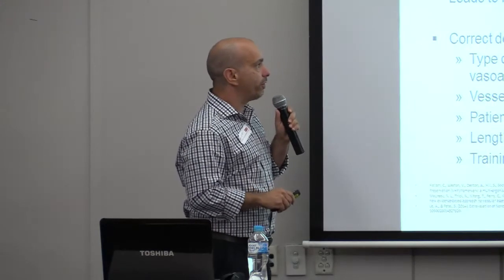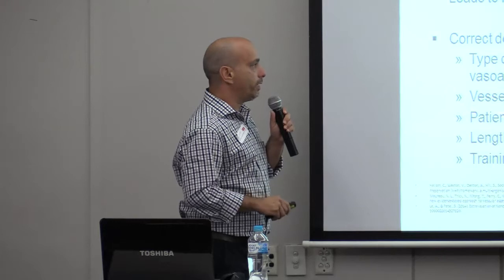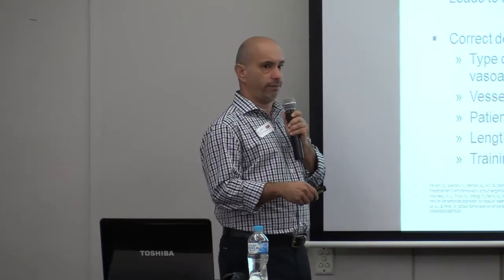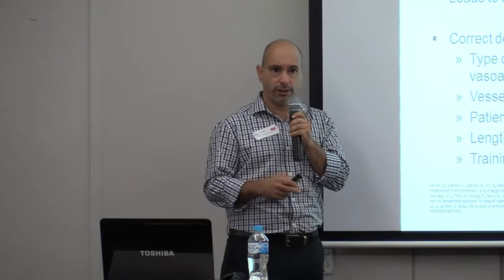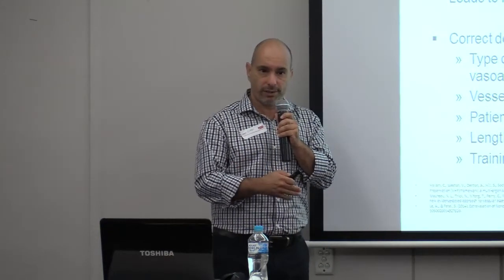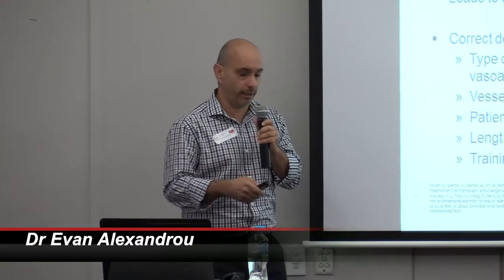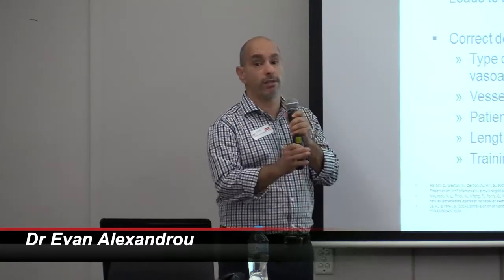So choosing the correct device is about thinking about what's going to go through that device. It's also about vessel assessment. Does this patient have visible or palpable veins? Do they have difficult access? And most guidelines and most associations will say that, if you've got 2 sites or less, then you need a pretty experienced inserter to put it in to reduce the risk of failure, but they're probably more leaning towards being someone with difficult access.